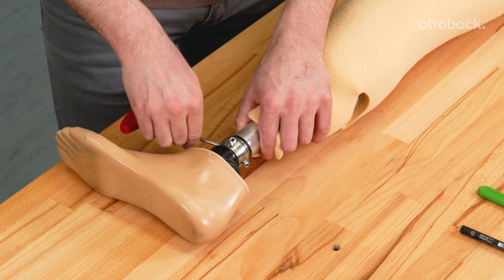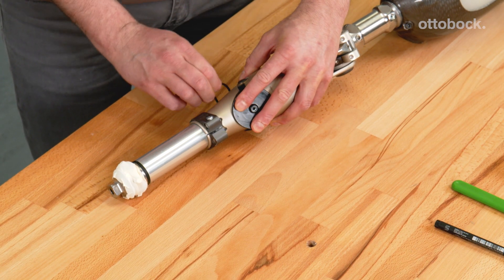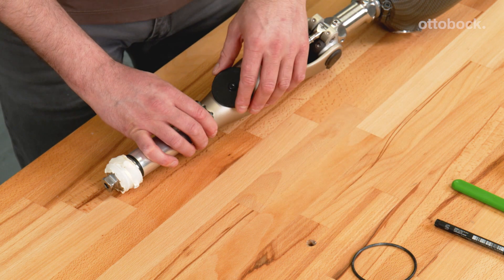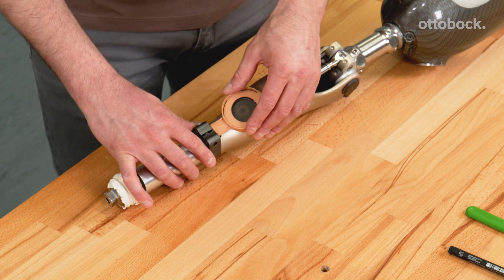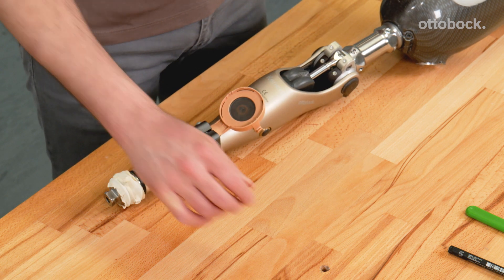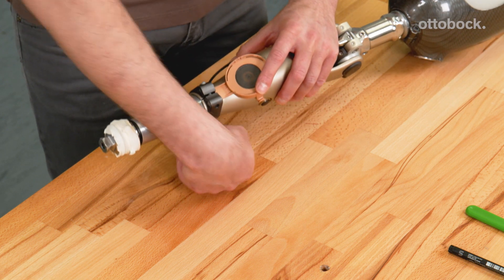Remove the foam cover from the prosthesis again and detach the centring plate from the Konevo. When installing the charging shaft receiver, please ensure the tongue-shaped extension is positioned distally. This snaps easily into the recess above the tube clamp. The O-ring can now be used to attach the charging shaft receiver.